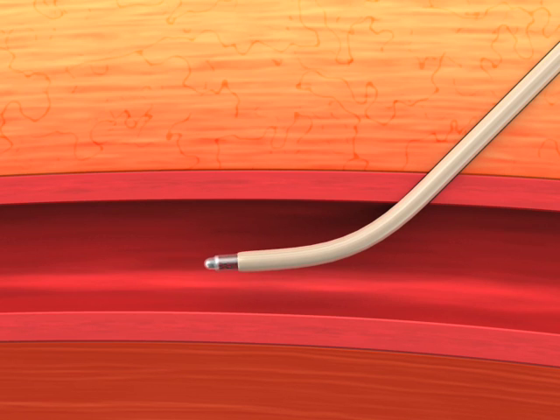The Cardiva catalyst wire is inserted into the vessel through the hub of the existing introducer sheath and the disc is deployed. The introducer sheath is removed over the Cardiva catalyst wire.